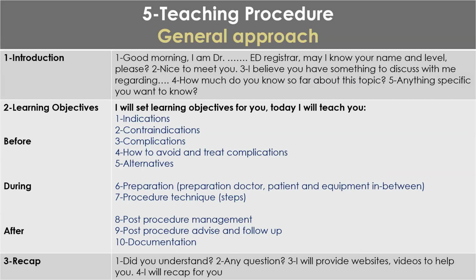So indications: to relieve the retention of urine. Clear? What else? To monitor the urine output. Maybe the patient has no urine retention. Like in ICU, any patient you will give fluids, you should insert a urinary catheter. Easy? So, number one, therapeutic, it means relieve the urine retention.